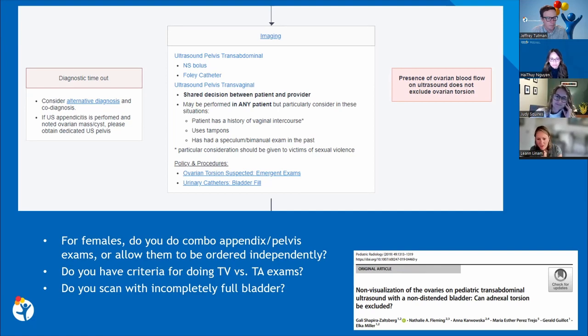have noticed that most of our ultrasounds come before a physician has seen the patient and lab work has been ordered. So, no exam, no labs, do they have appendicitis? Well, if we can't find the appendix, what does that even mean?